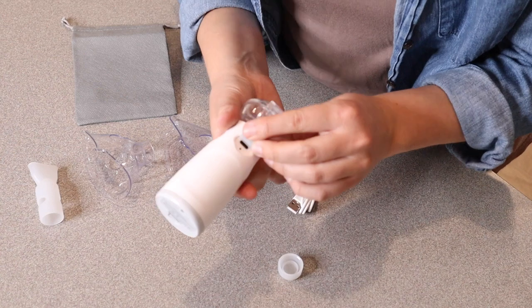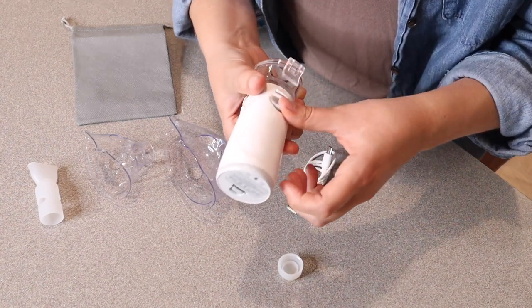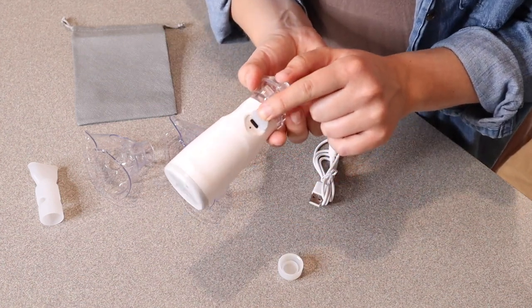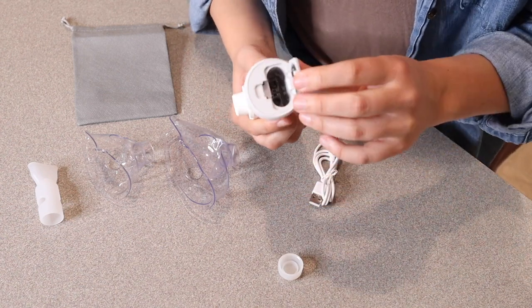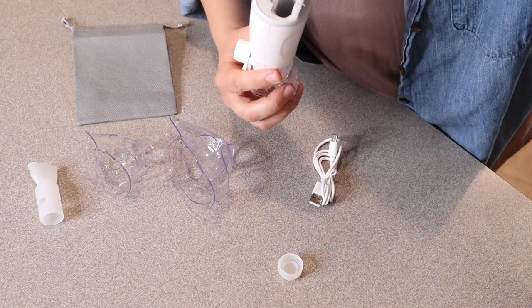Something I like about this nebulizer is that it does have a charge cord, so this can be fully charged up and you can take it with you on the go. This is where the charge cord goes to get it charged up. And then this is where your batteries go right here in the bottom — it takes two AA batteries.